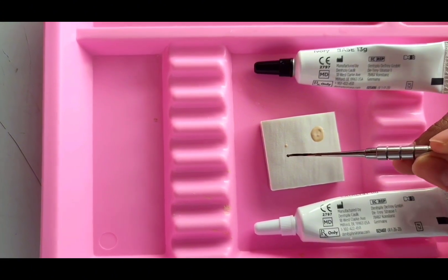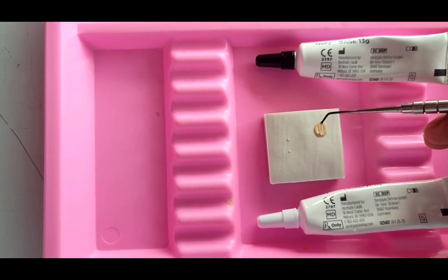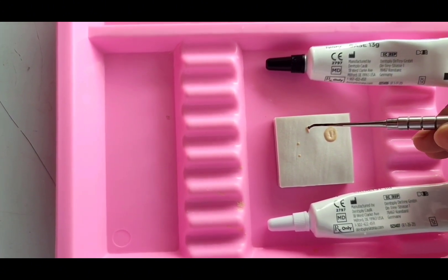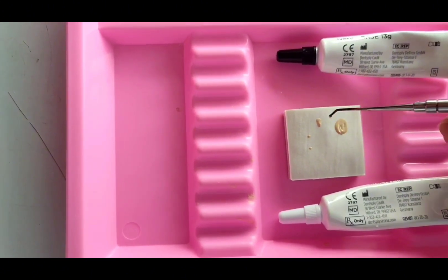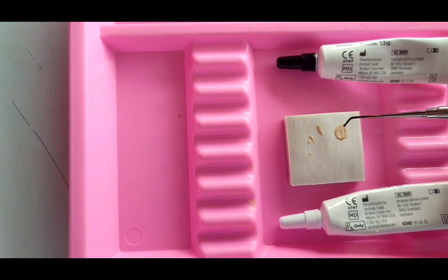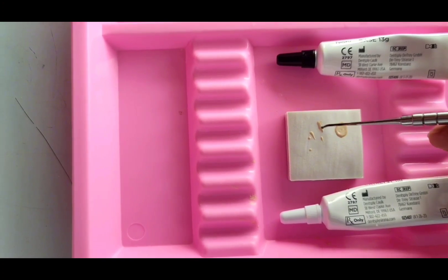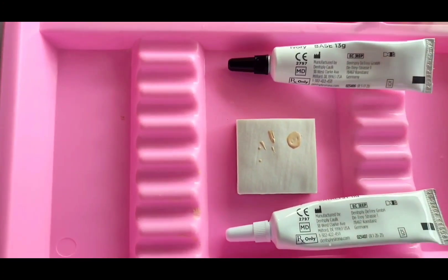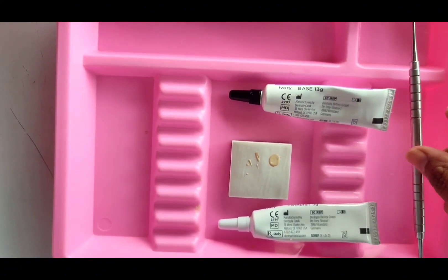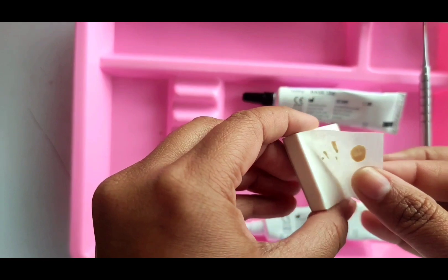Place the mix directly on the exposed pulp and cavity dentin in a thin layer of less than one millimeter remaining thickness. Avoid placing Dycal liner on enamel or margins of the cavity, and avoid placing large bulk of material — thickness should be approximately 0.8 to 1 millimeter. Allow the Dycal liner to completely set; the mixed material will set in approximately two to three minutes on the mixing pad under normal room conditions, and setting time is shorter in the mouth due to moisture and temperature.